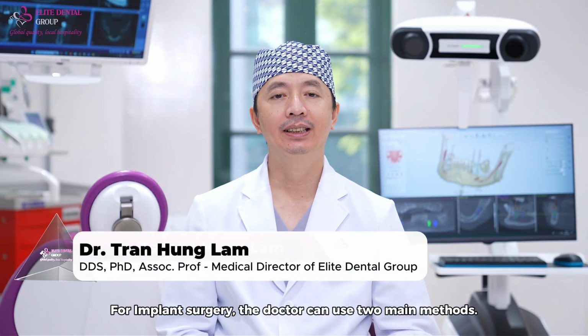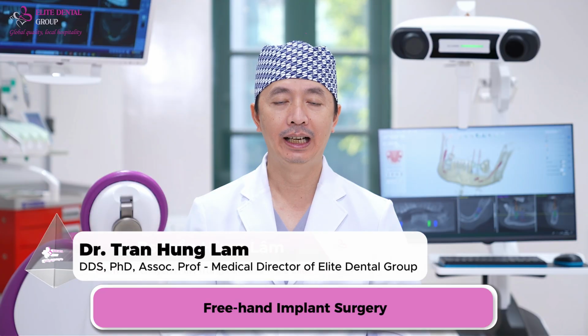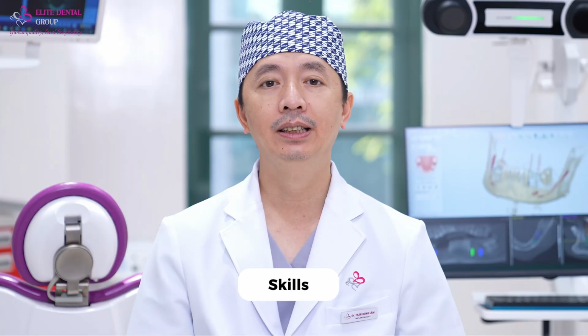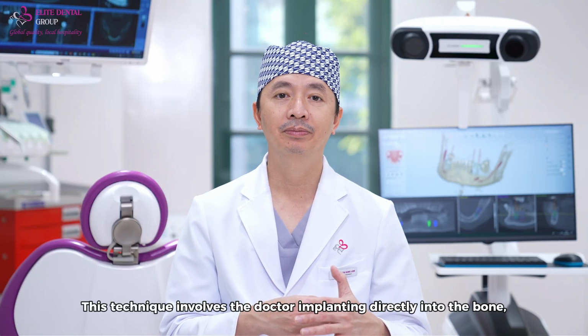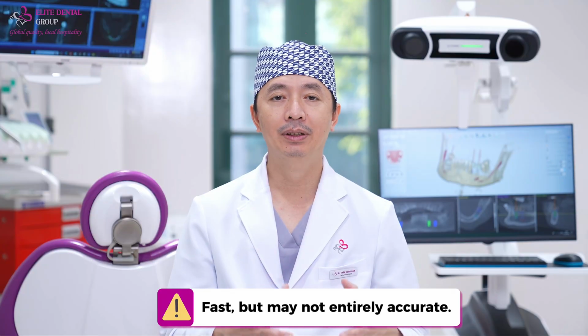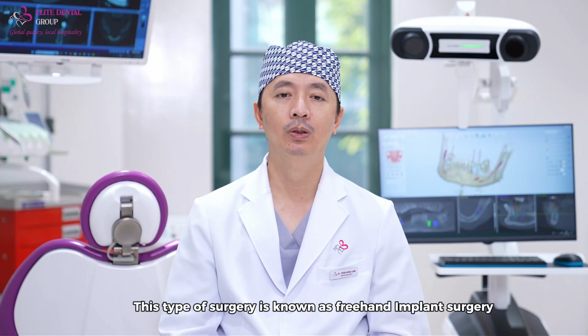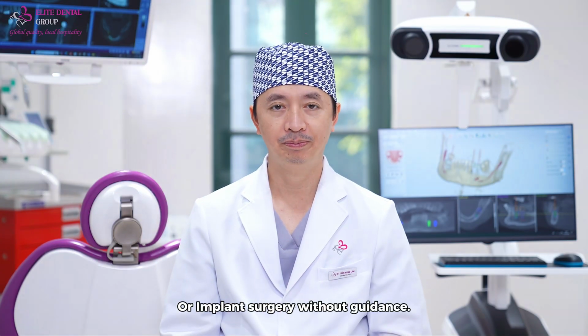For implant surgery, the doctor can use two main methods. The first method is called freehand, where the doctor implants based on their experience, knowledge, and skills. This technique involves the doctor implanting directly into the bone, which can be quite quick, but the positioning may not always be entirely accurate. This type of surgery is known as freehand implant surgery, or implant surgery without guidance.